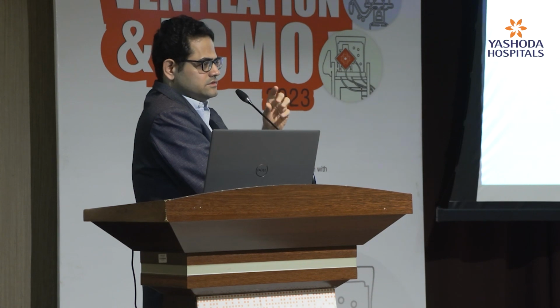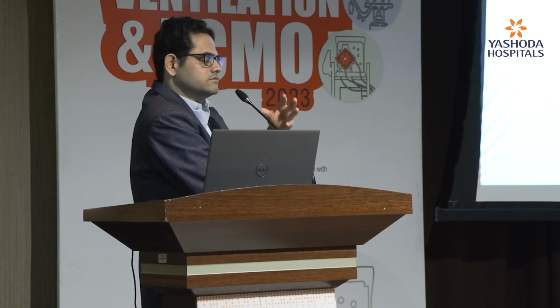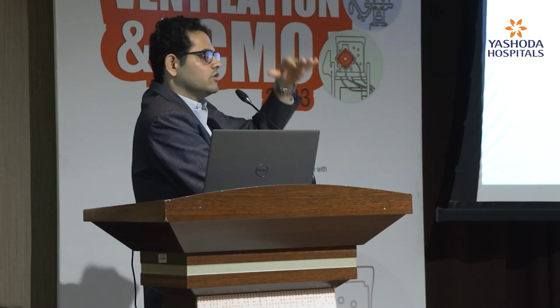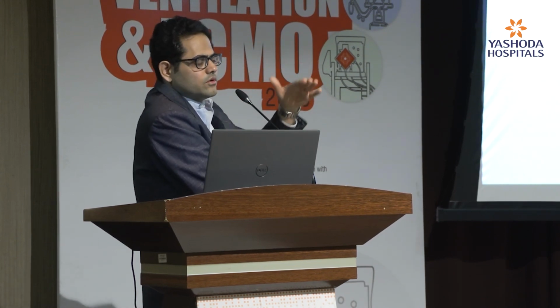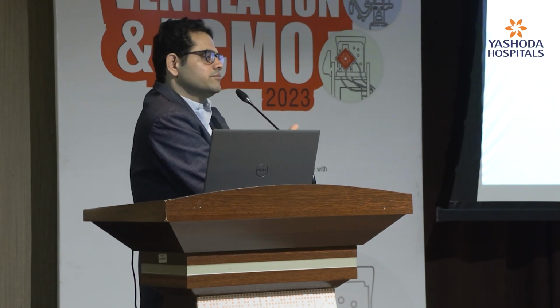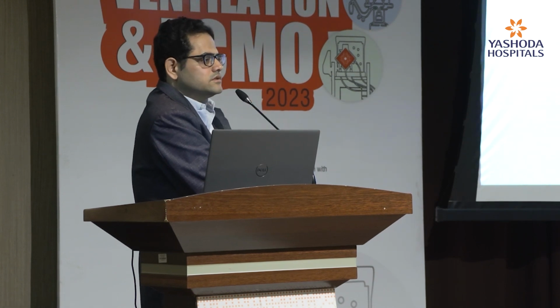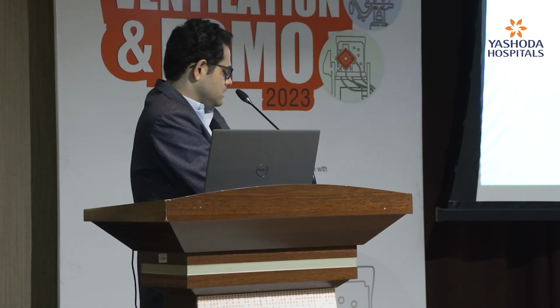Many times, though there is no physiological benefit, ARDS is ventilated in pressure control mode so that there is better oxygenation, but we forget to check the volumes. As the compliance worsens over time, the volumes will go on dropping and dropping. Similarly with volume control ventilation, the pressure may go up and we may ignore the pressure. So always look at what the scalars are telling, what the loops are telling, and what the ventilator alarms are telling. Okay.